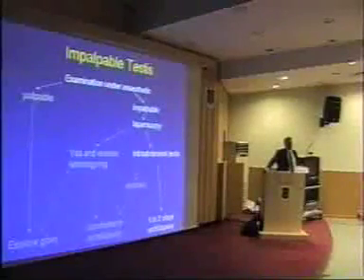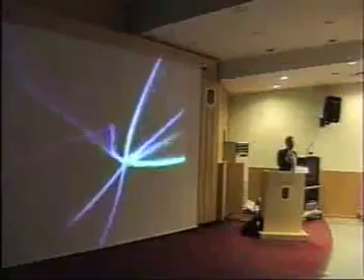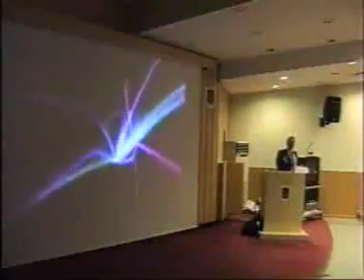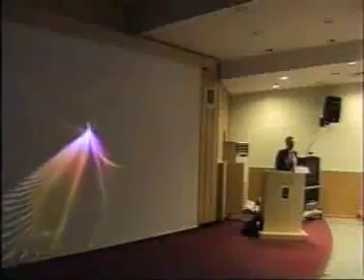Okay? But I think you just got to decide on your approach, and it would be perfectly fair if you wanted to do it retroperitoneally. The thing is, if you do it transperitoneally, you're straight into your space, aren't you? The peritoneum is the ready-made space in which you can work, and that's easy. Retroperitoneally, the difficulty that I found was creating space for the balloon, and that's one more step that you have to do in a retroperitoneal nephrectomy that you don't have to do transperitoneally. So I think that's something to consider.